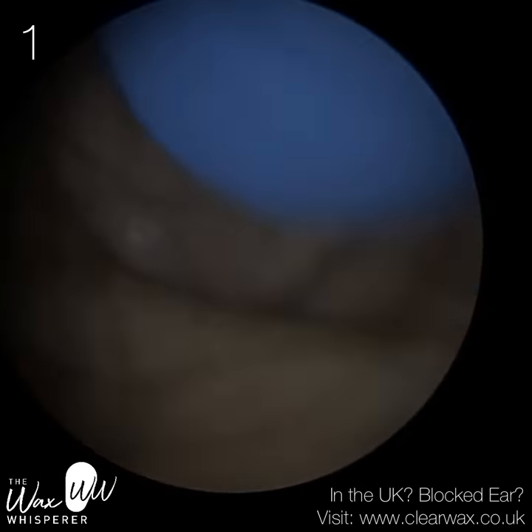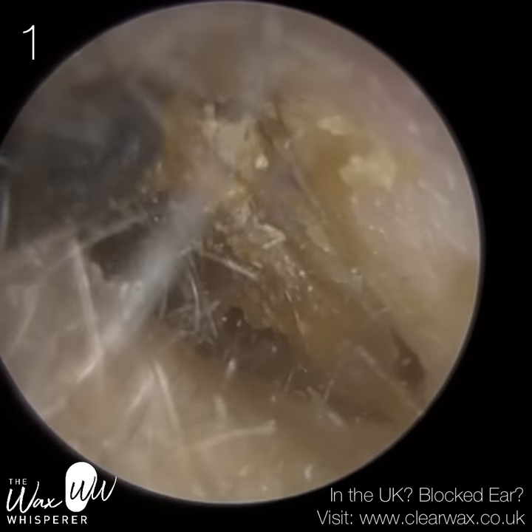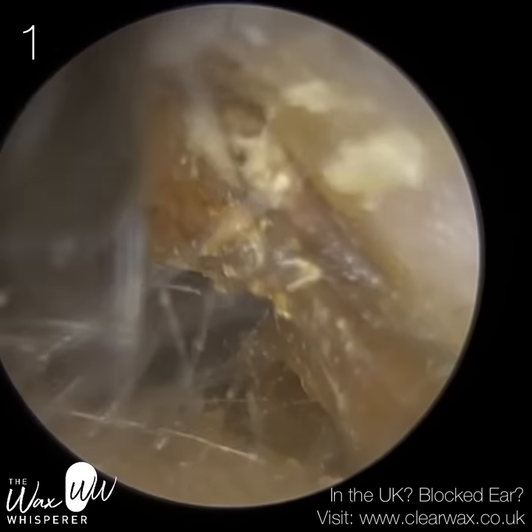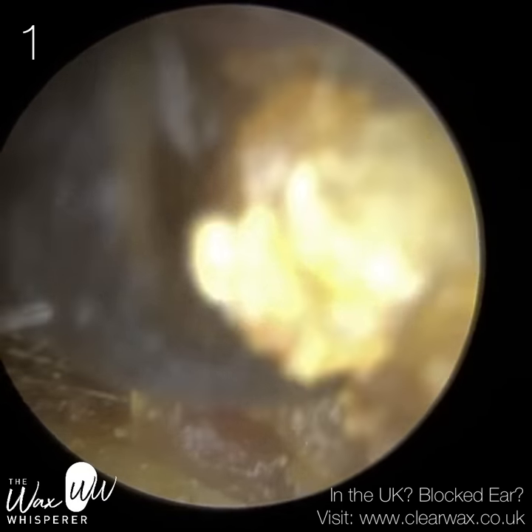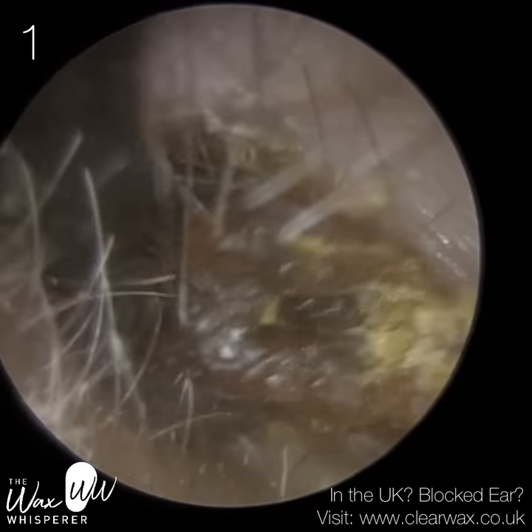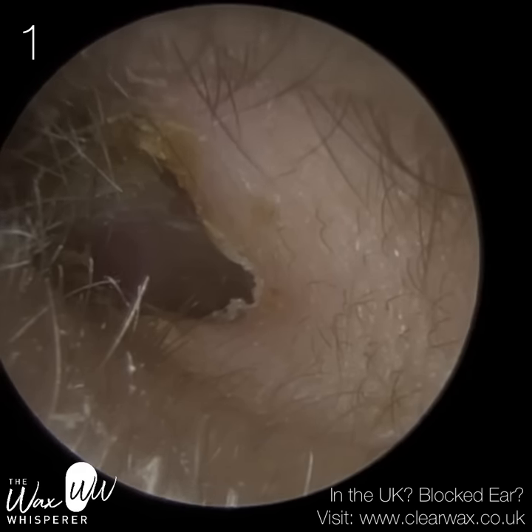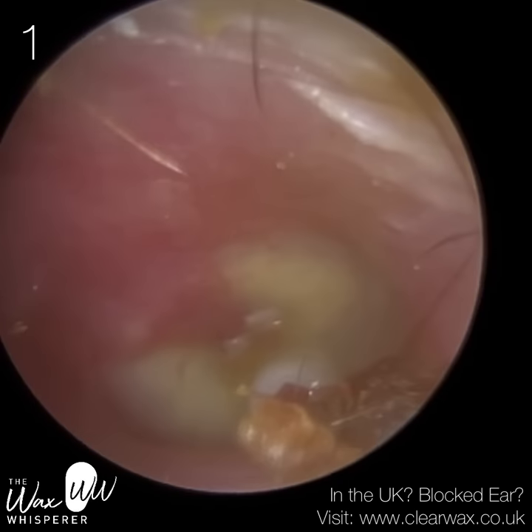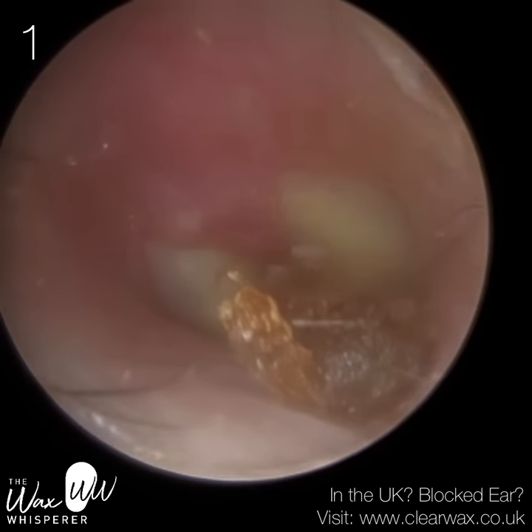She's got a very, very narrow lateral aspect of the ear canal. When we say lateral, we mean near the entrance, and I'm just using an ear hook to try and prise this away. It's a bit unusual because my auntie doesn't usually suffer from earwax or dead skin buildup. At this stage, I was unaware that her ear was infected. But in a minute, you're going to see that my auntie actually has a grommet as well, which I'm going to explain in more detail during the course of the video.